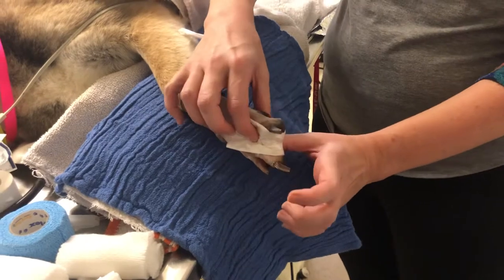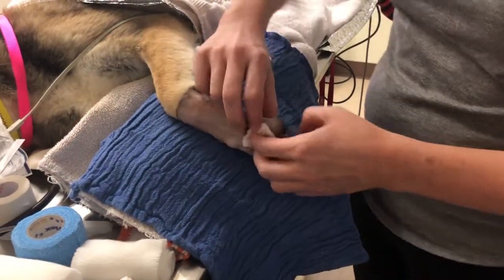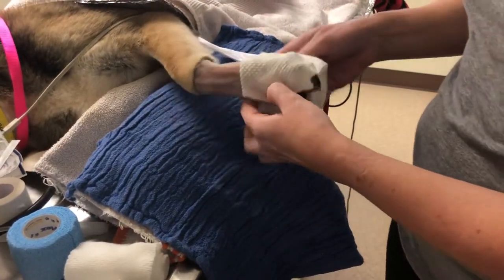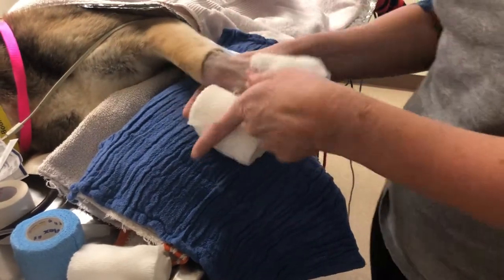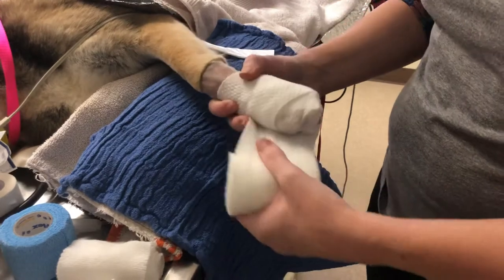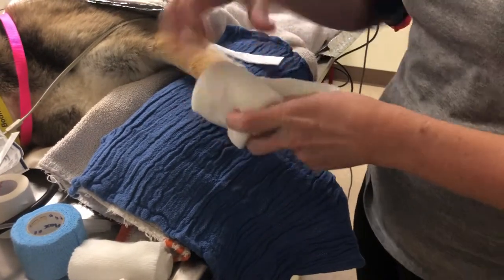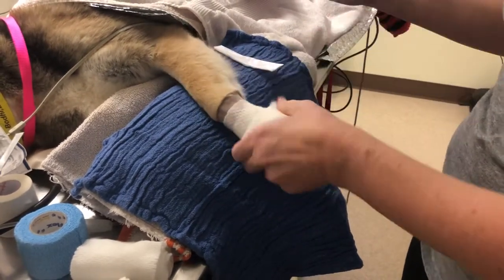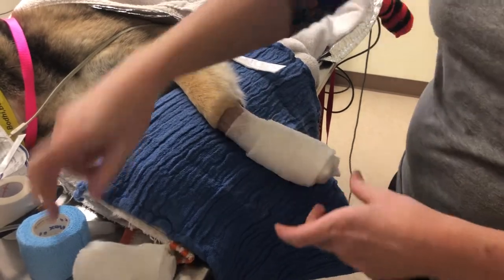Then I'm going to put a little bit of cast padding over the whole foot. This is absorbent and provides some cushion. I don't feel the need to put any between the toes — I think they'll do just fine. I'm going to go over the toes completely, but I don't want this to be too bulky, so I just do a few layers like that.